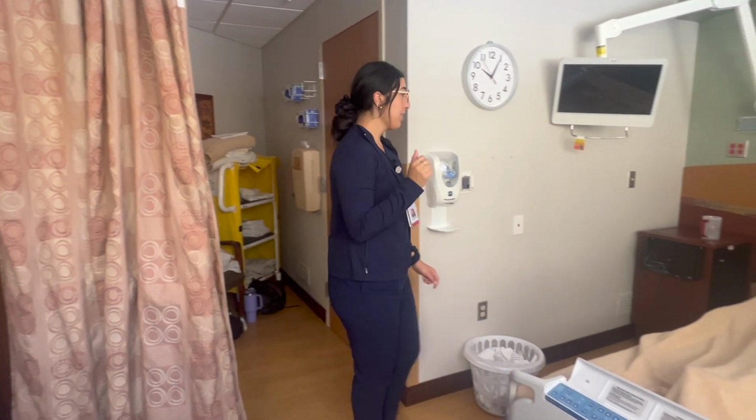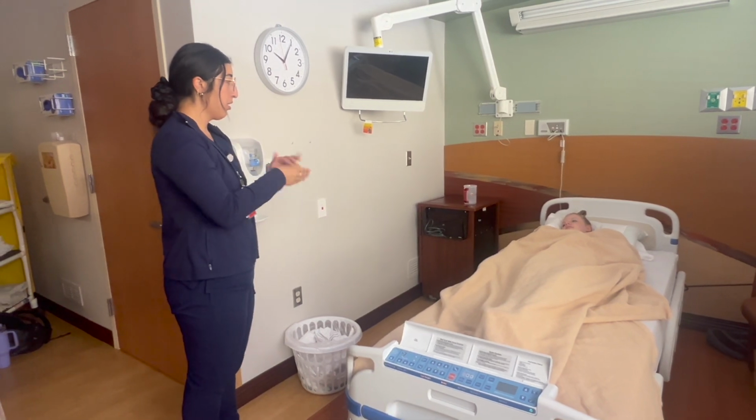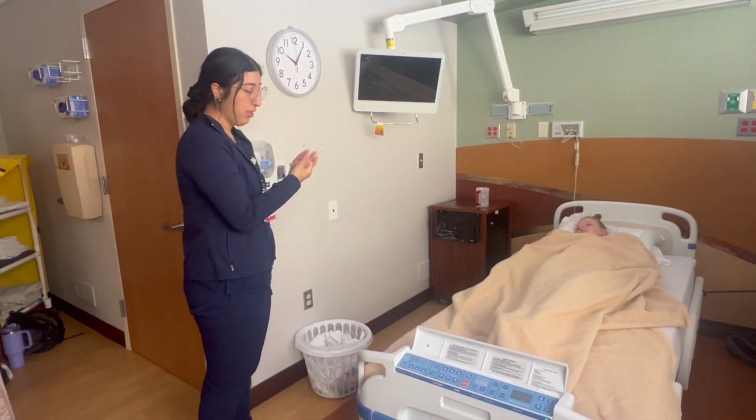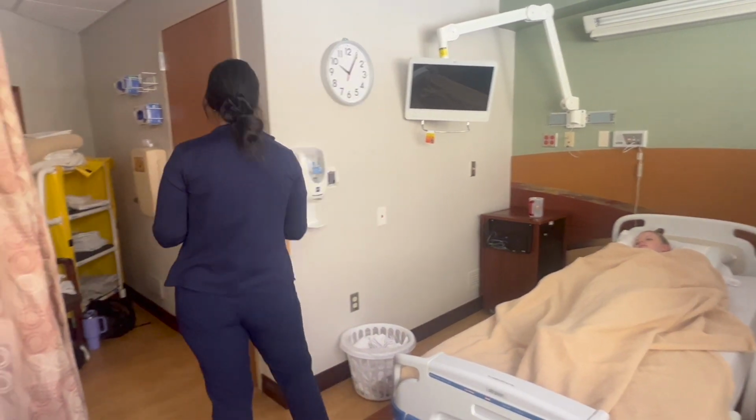Hi Alicia, I'm Carissa. I'm going to be your CNA today. We are going to change your bed linens with you laying in the bed. Okay, we're going to start with our hand hygiene. We're going to go grab our stuff.